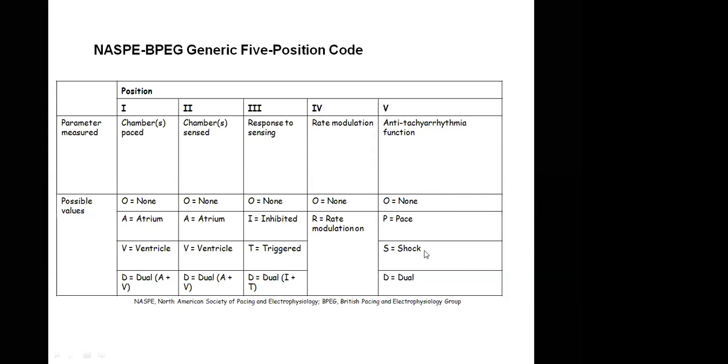Okay. Another option is, if the anti-tachycardia pacing method is not working, then it can release a DC shock. So usually it shocks at a Joules of about 35, 50. Usually it will not go above 50. That's 35, 50 Joules. Okay. So we can go on, Abby.